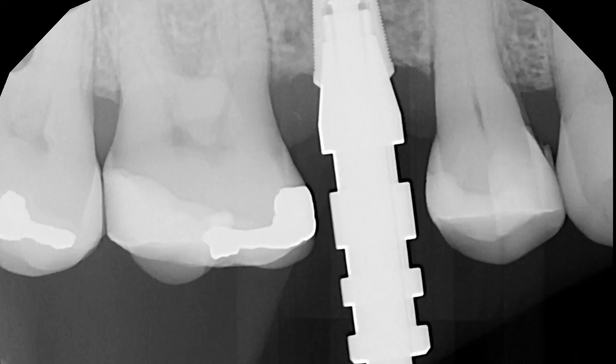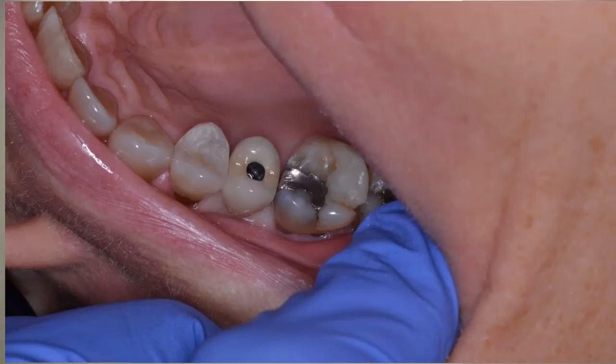Here's a photograph now of the crown that's been put into place. And just like any other crown in crown and bridge dentistry, what we do is we'll seat our crown in.